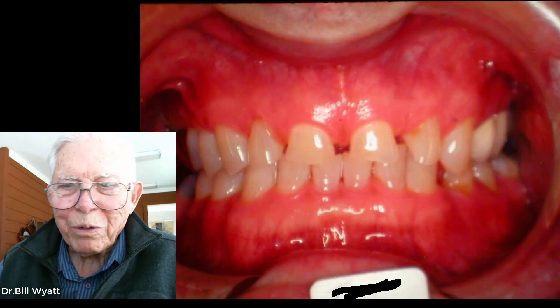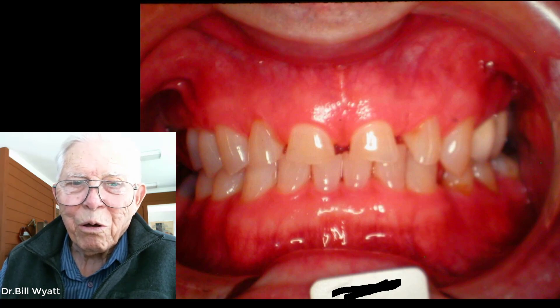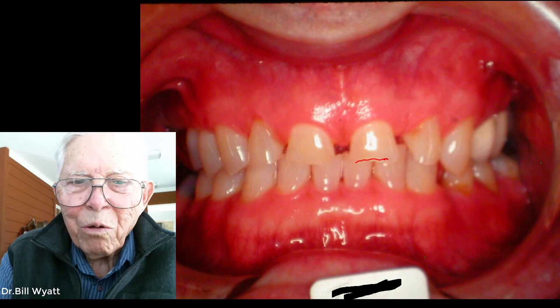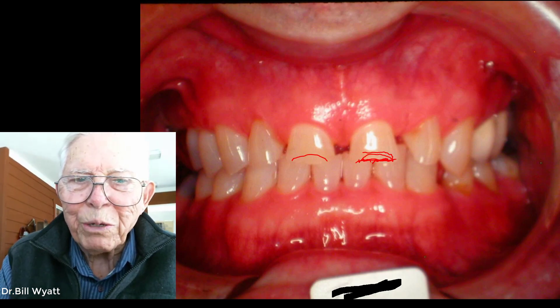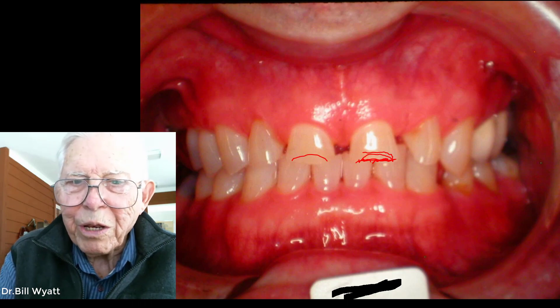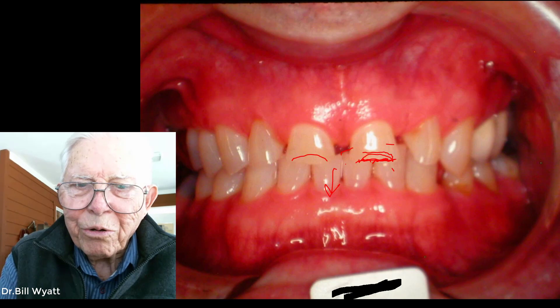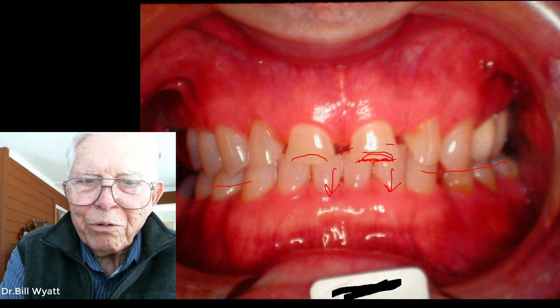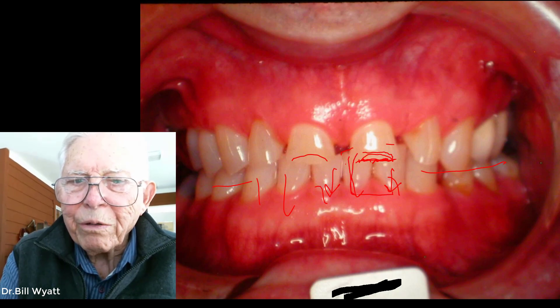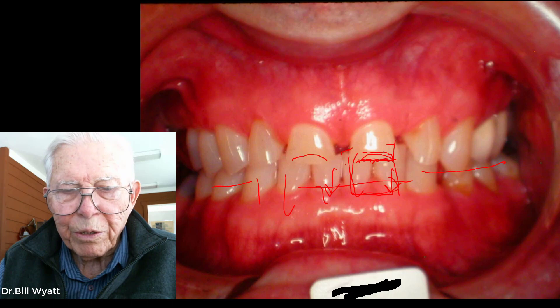I want to show you these teeth — this will be a pretty short video. The teeth are ground off; it looks like more than half of the upper centrals are gone, and you can see the enamel kind of hanging over there. Once you get up that thick on the tooth, there's a lot of dentin, and it'll be ground off up inside. He's got a closed bite too, so we're going to have to lower the anterior teeth and put some material on the bottom. He didn't want orthodontics, so we'll lower them down where we can build these teeth and give them length, with the lower teeth below.